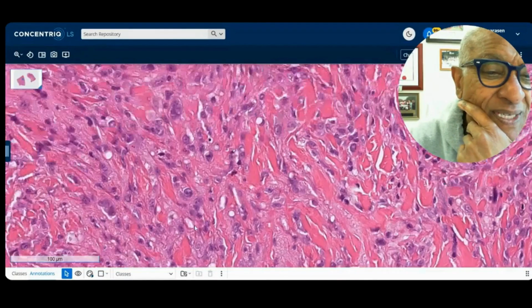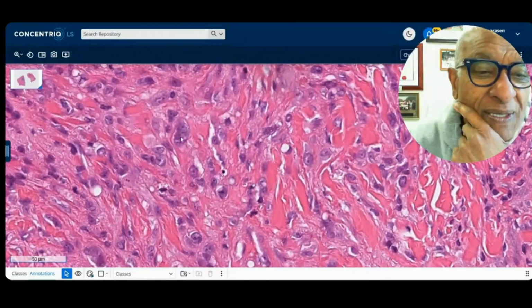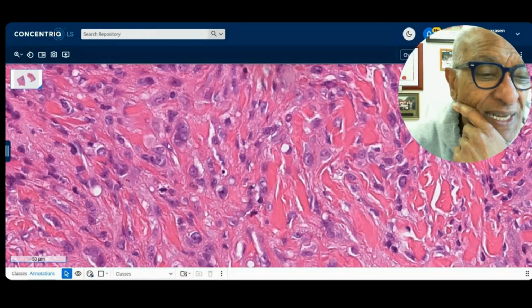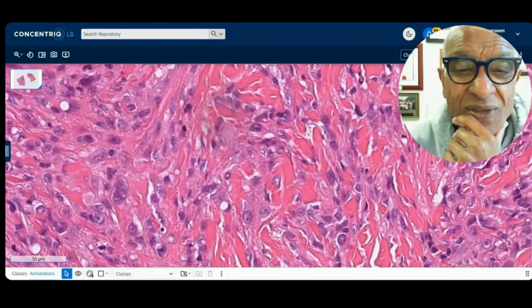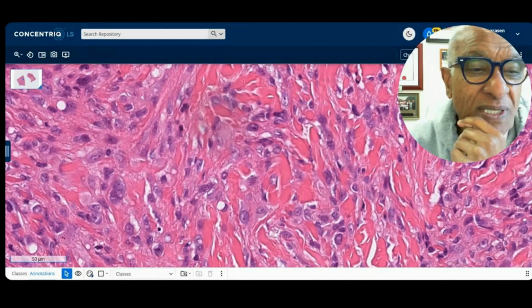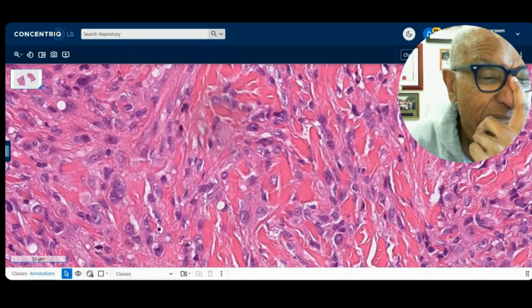All right. And here you can see these nuclei. This one's probably binucleated, varying size and shape. Some of them do have some dark chromatin, but others have just finely vesicular. Here's another. These are all tumor cells. I'm just pointing out some ones. This looks a little pinkish. All right.